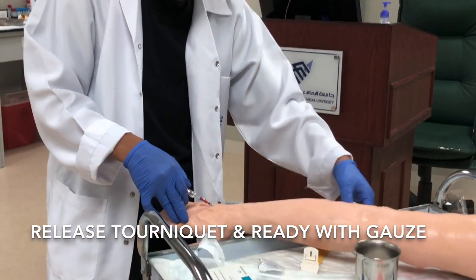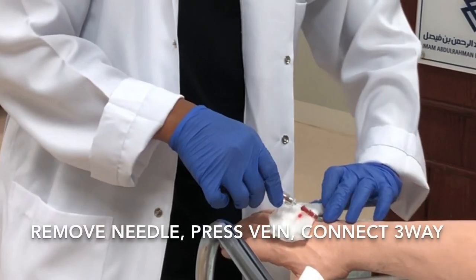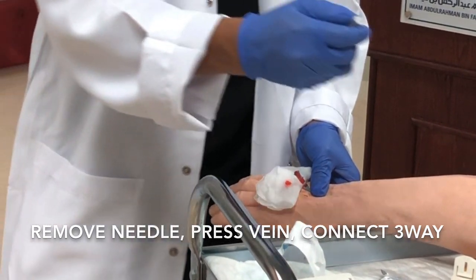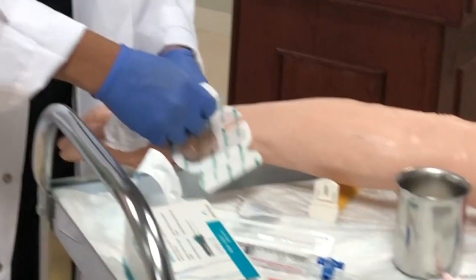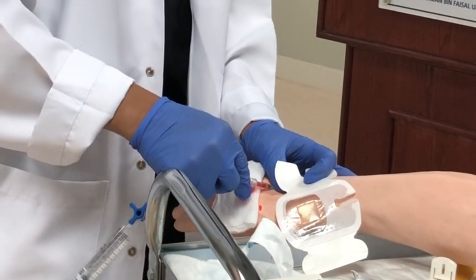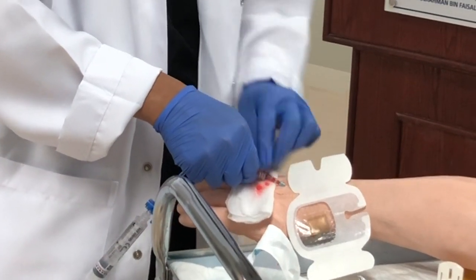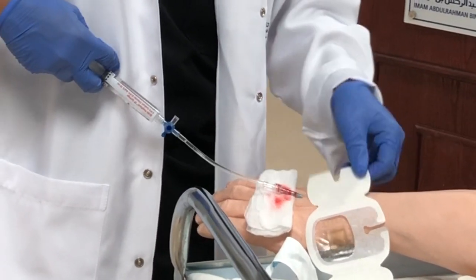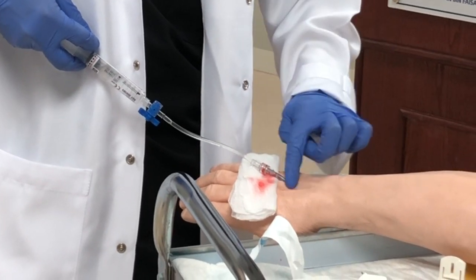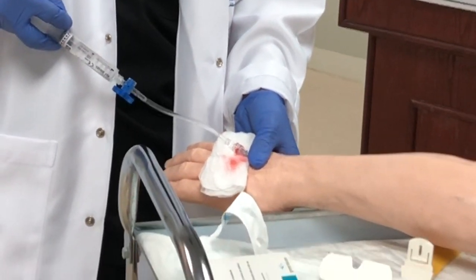Then you need to release the tourniquet. You can put a small gauze and don't forget to occlude the vein. Connect to the three-way saline lock. Check if there will be no bulging — observe carefully. If there is bulging, you need to reinsert and find a new site. If there is no bulging and no pain, you are good to proceed.